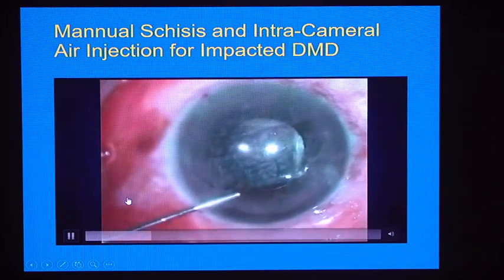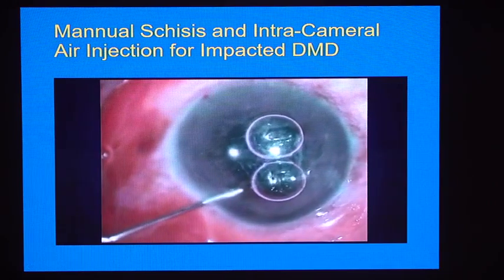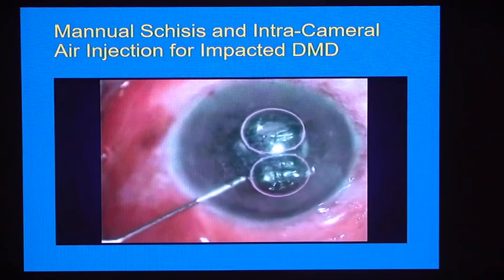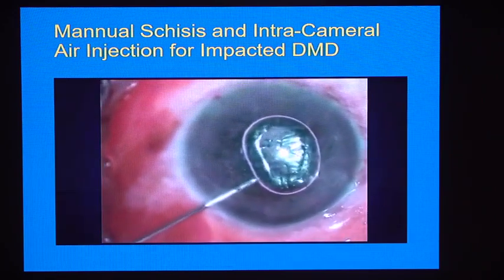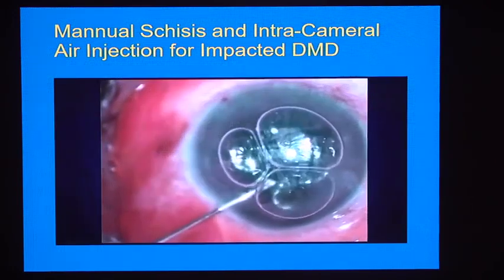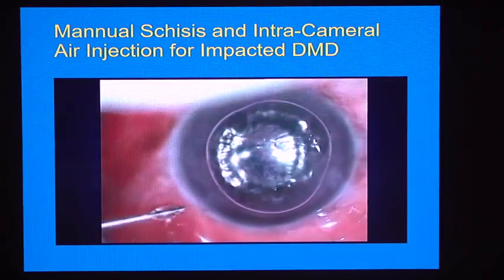You can see that we have made the inferior paracentesis, and this Descemet's membrane was basically stuck to the posterior corneal surface. We thought we will negotiate the cannula between the cornea and the Descemet's membrane detachment and put the air bubble, and it will get lifted. But since it was stuck, we were not able to do that. So air bubble injection was not of any use.